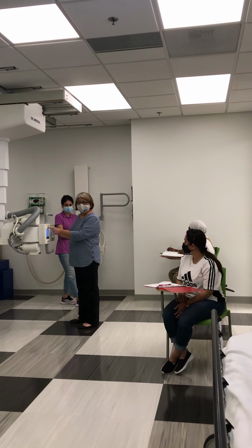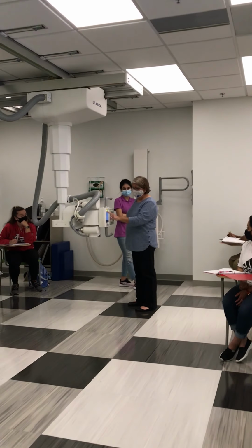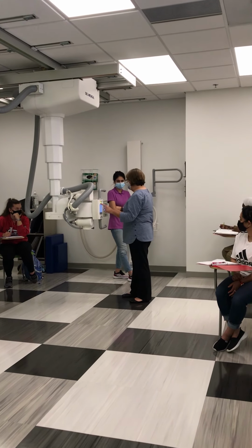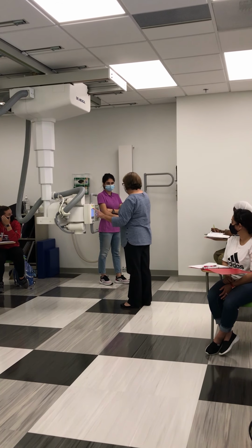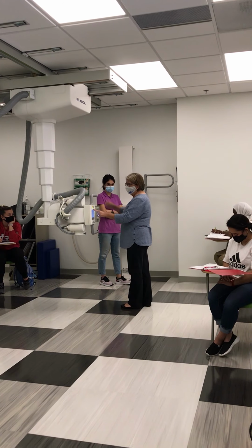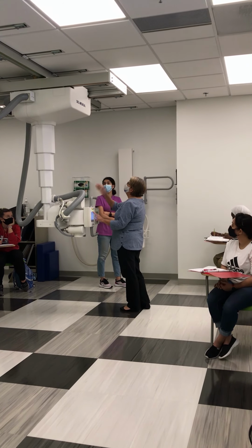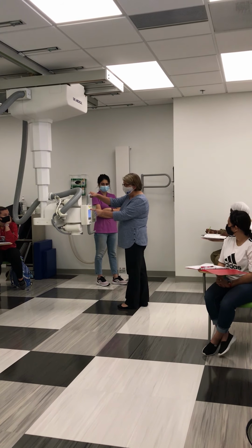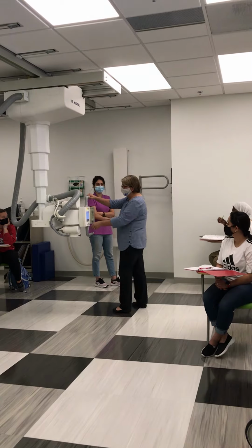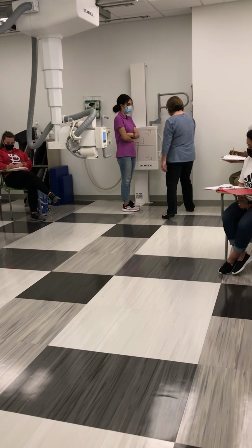And that's what you need to look for to be in detent. Transversely, if you're in detent, you'll see that light next to the orange button. If you're at the wall bucky and you're supposed to be at a 72-inch SID, then your light will be on next to the green button in detent.